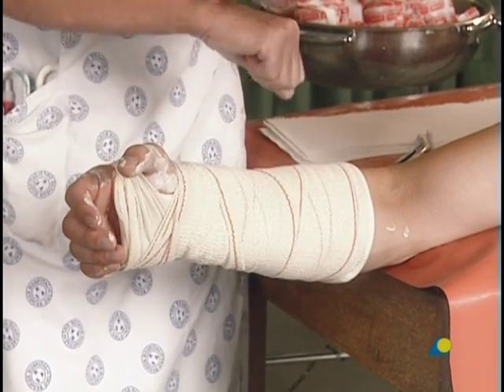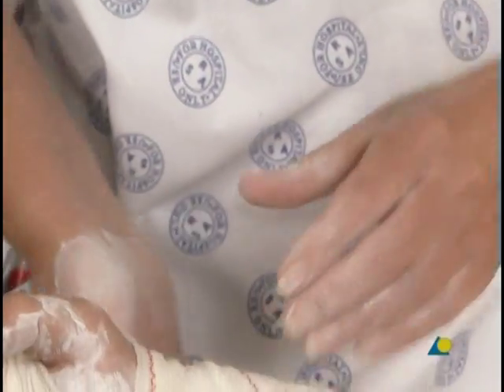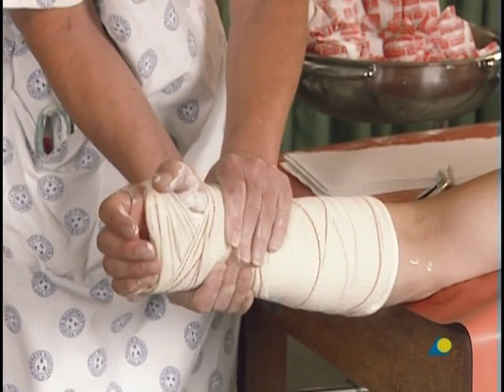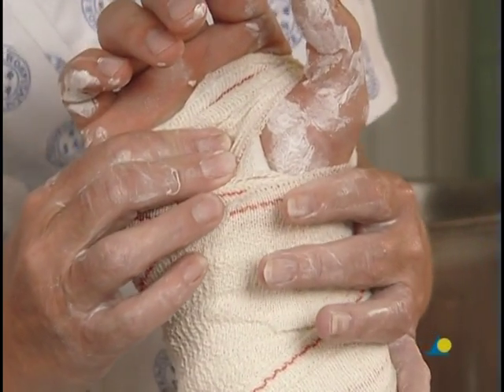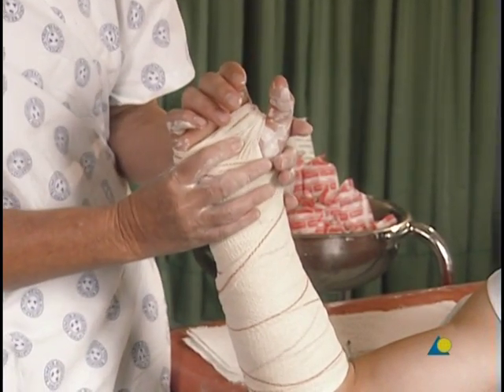To secure a better fit, the molding of the slab should take into account the oval profile of the forearm. The slab is then molded to the palm of the hand while the fingers are flexed to an angle of 90 degrees.